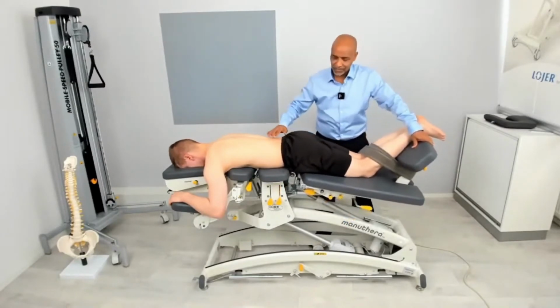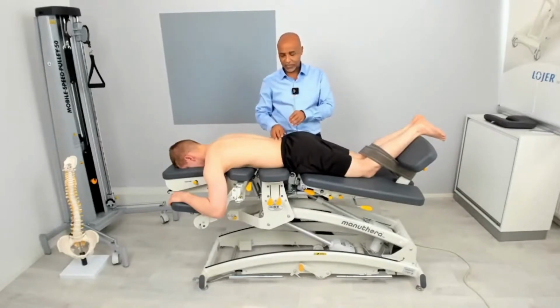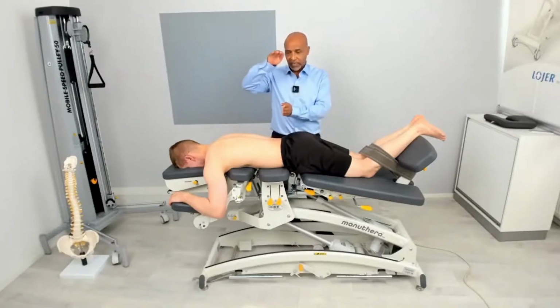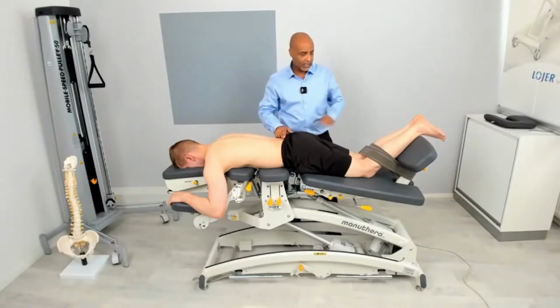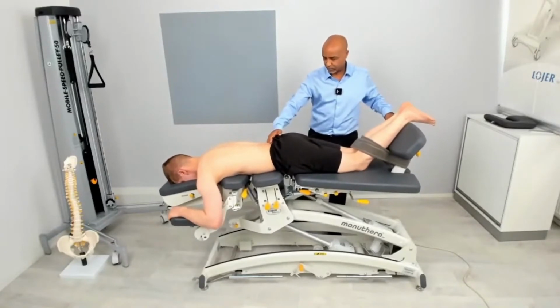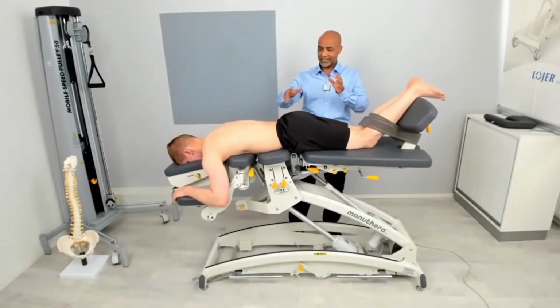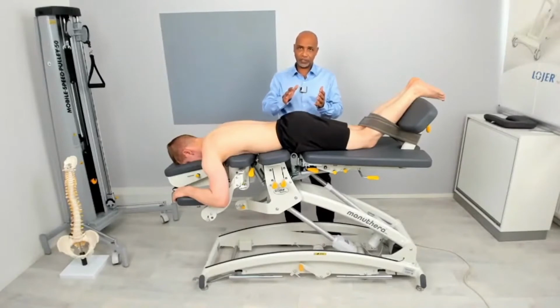So we started on the muscles, the upper layer, and then we moved into the ligaments. Now we need to start thinking about how to approach the disc itself and how to reduce the pressure from the disc, because it's level 1, level 2, and 3. So the disc will be on level 3. How I'm going to do that is to increase the height a little bit and also the tilting. You don't want to treat a disc which is under pressure, so we need to remove that pressure from the disc.